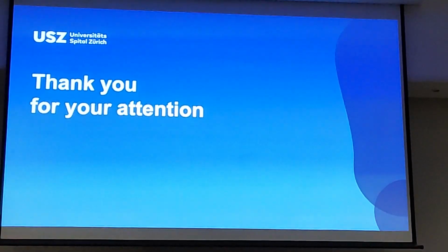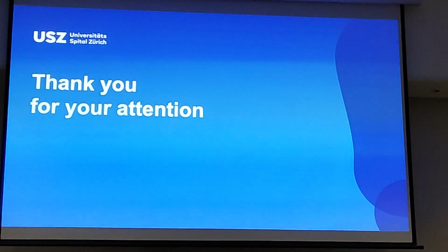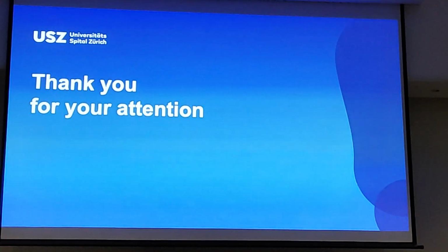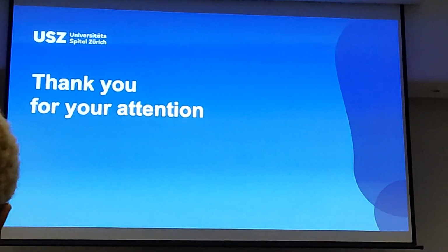And as I said, just do it, because it's easy to learn. With those handheld devices you don't need to push around the big machines. The big machines are better to some extent when you have difficult questions, but those handheld devices you can take anywhere you want. You can use your cell phone to connect to those transducers, and you get the information you want right wherever you are with your patient. Thank you for your attention.